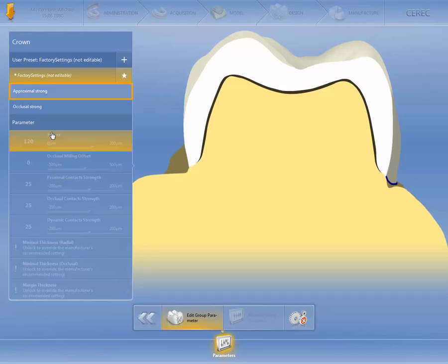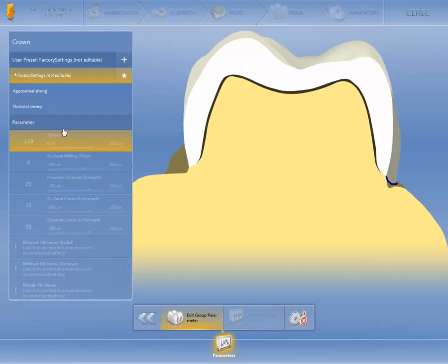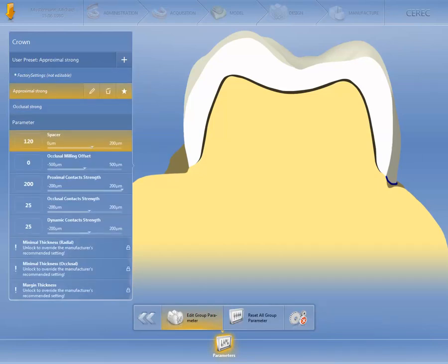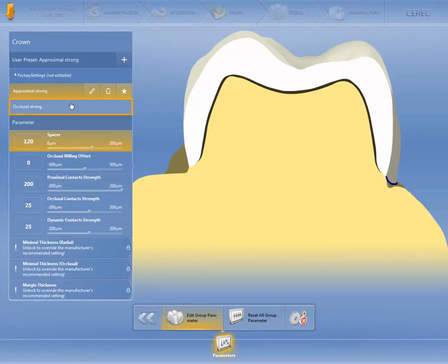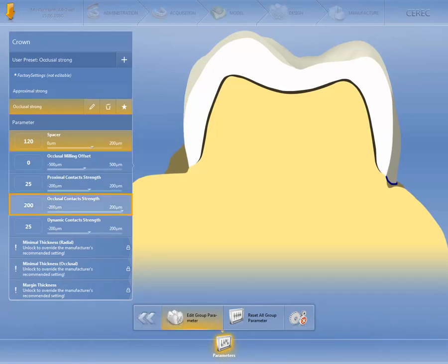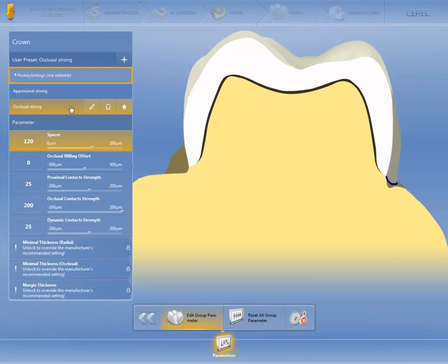However, you have the option to configure individual parameter profiles and later select them for certain restorations when required. To illustrate this, we have created a profile for a strong proximal contact strength as well as for a strong occlusal contact strength. In order to show the difference between the various profiles later on, we have saved the proximal strong profile with a maximum proximal contact strength, and the occlusal strong profile with a maximum value for the occlusal contact strength. The profile marked with an asterisk is the master profile — in this case, it contains the factory settings.